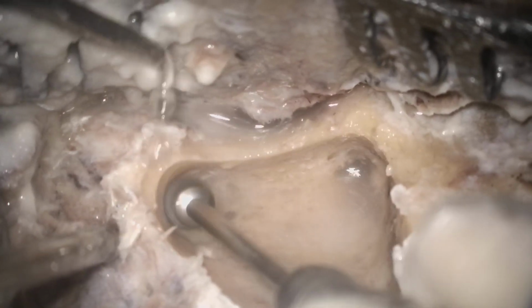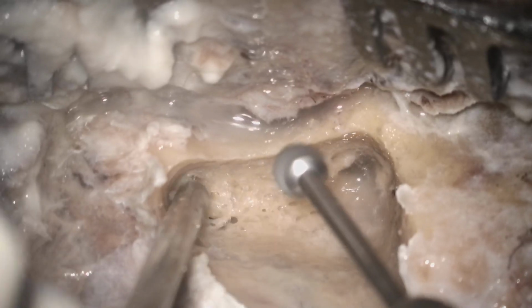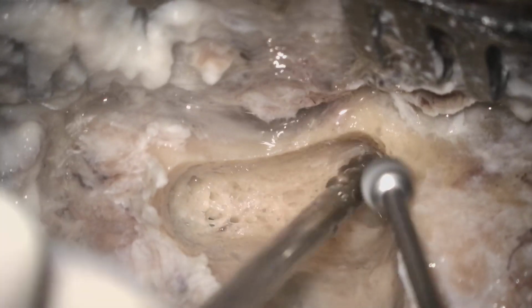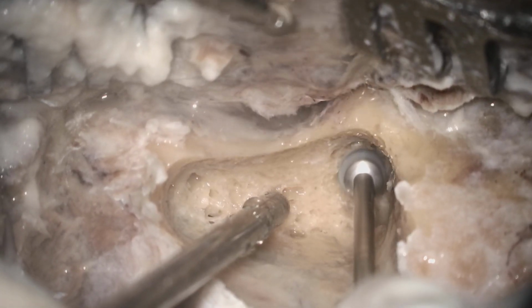Okay, sir. And now you will get the digastric ridge at that part. You just continue drilling. So the digastric ridge is basically the prominence of the attachment of the digastric tendon inside the mastoid cavity. It identifies the landmark for the facial nerve at the stylomastoid foramen.